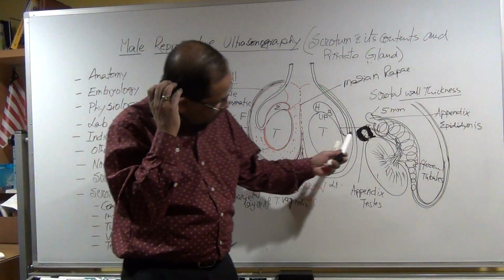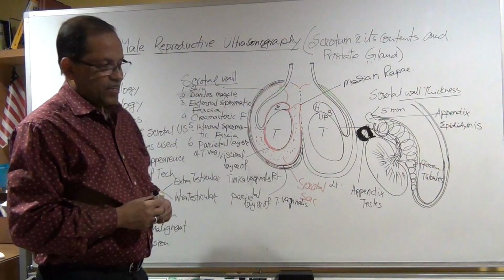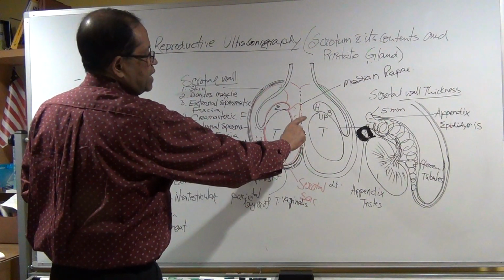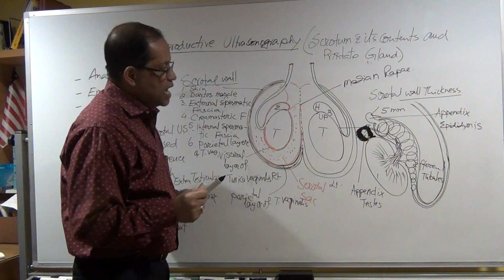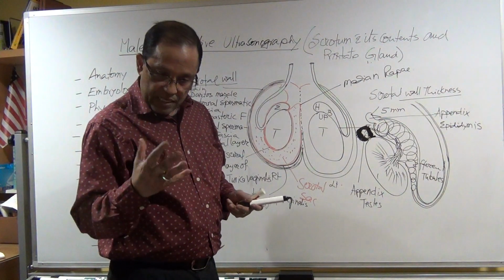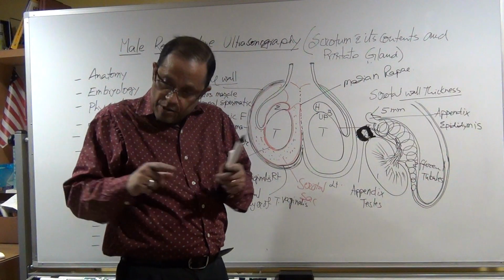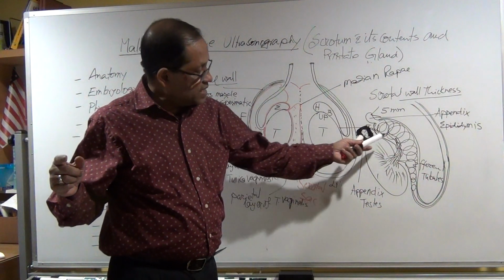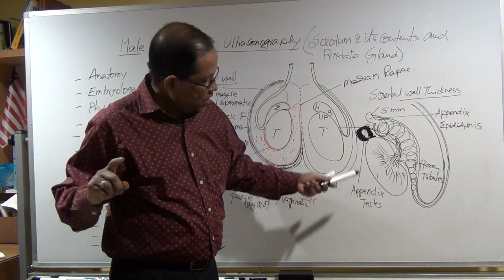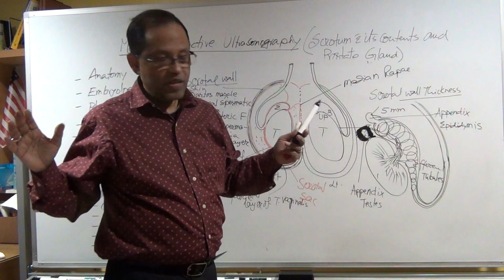Sometimes they will give you this diagram and ask you, what is this? Okay, so this is epididymis. And most of the time you will see the head seen with the testis, and if there is a local focal infection, it is in the head. When there is a diffuse infection, then we can see the body and tail. Otherwise body and tail we cannot see. And when there is diffuse infection, then head, body, tail are all visible and highly vascular.